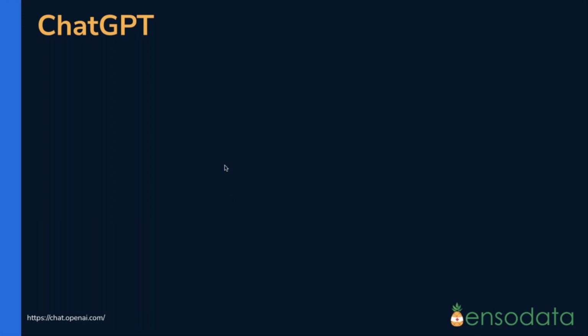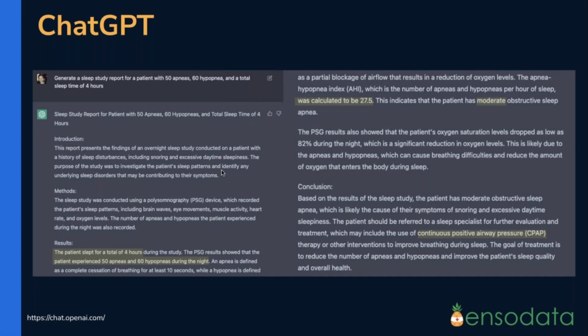So what I did is I basically tried the first thing that came to mind, at least in my mind. And I basically asked it to generate a sleep study report for a patient with 50 apnea events, 60 hypopnea events, and a total sleep time of 4 hours. Now, I won't read the whole thing, and obviously this is not a perfect report, and these reports are highly dependent on the preference of the different sleep physicians.